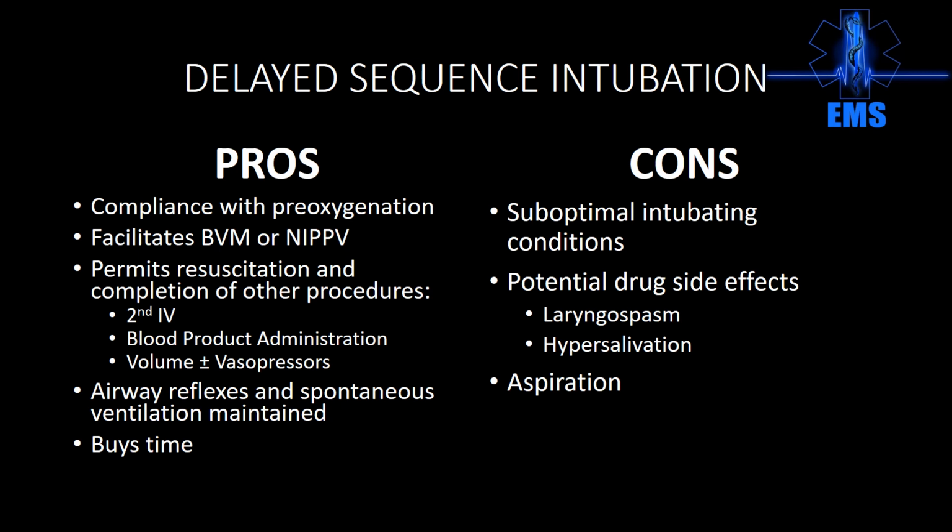So what are the pros of DSI? Well, number one, it helps people comply with pre-oxygenation and passive oxygenation or apneic oxygenation. It facilitates bagging or noninvasive positive pressure ventilation. It'll give you an idea what the patient's going to do by putting the CPAP on the patient. And if they tank as we're putting positive pressure in, then the intubation is not going to make anything better. In fact, it's going to make it worse.